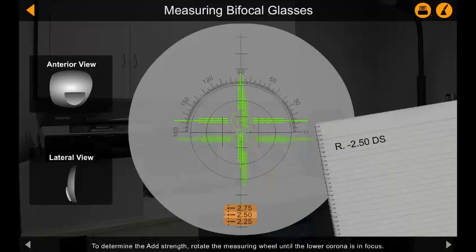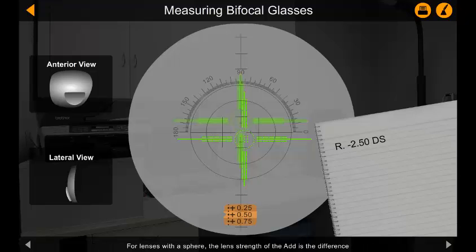To determine the add strength, rotate the measuring wheel until the lower corona is in focus. For lenses with a sphere, the lens strength of the add is the difference between the distance power and your current diopter scale value. The add in this example is therefore plus 3 diopter sphere.